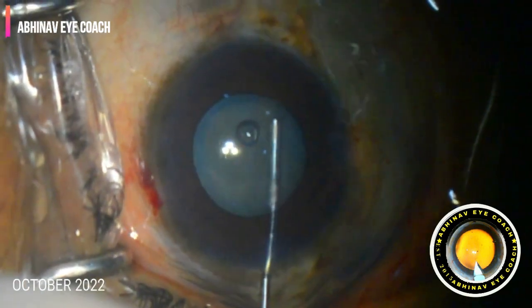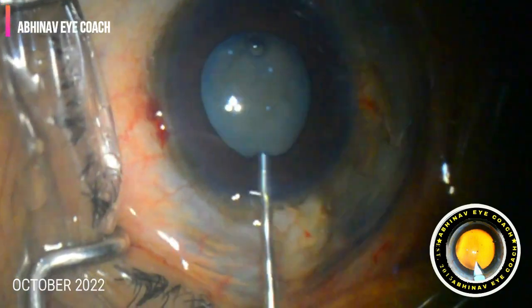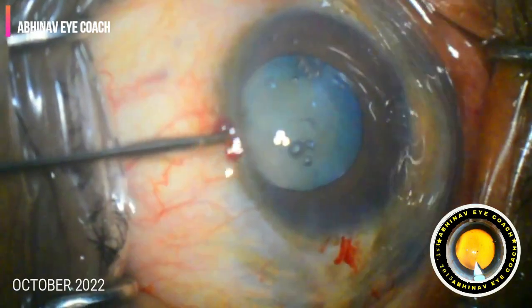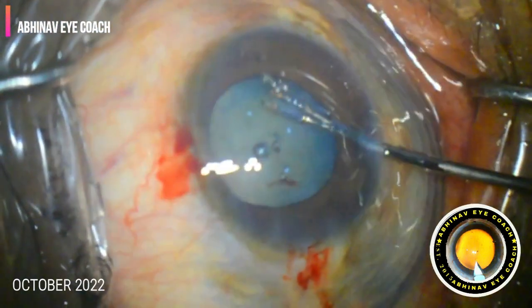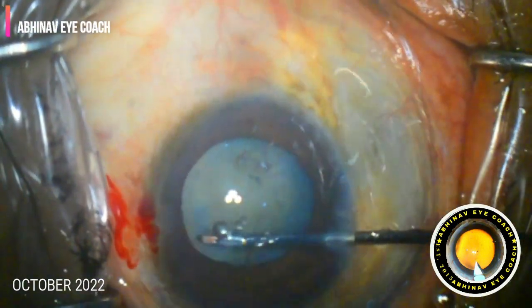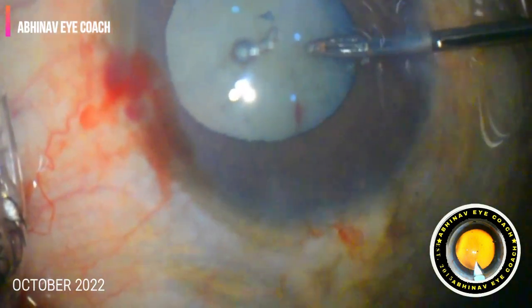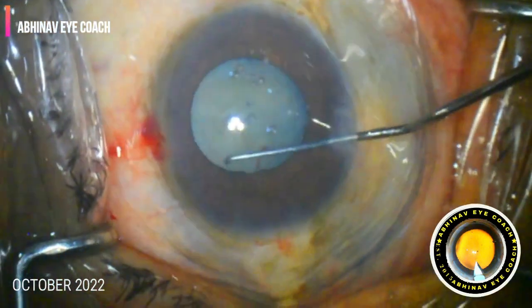The snap sign happens because of a sudden break in the posterior capsule. This can occur due to various reasons. First is a defective posterior capsule leading to a posterior capsule tear — although I performed a very gentle and slow hydrodissection, it still happened. Another reason is the pressure cooker sign, where excess fluid suddenly accumulates behind the nucleus and between the posterior capsule, and that pressure breaks the posterior capsule.